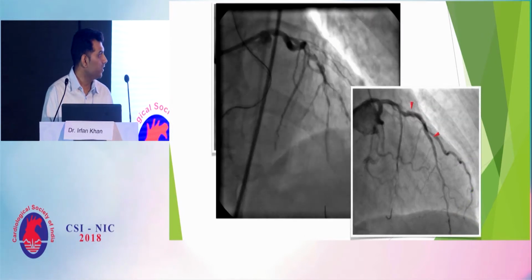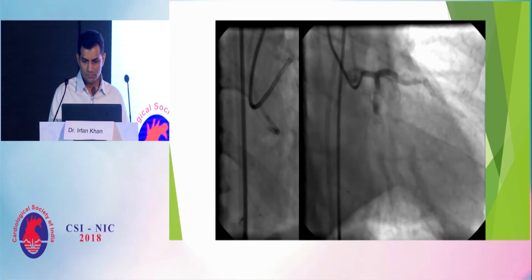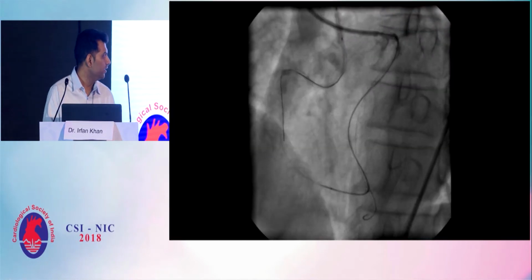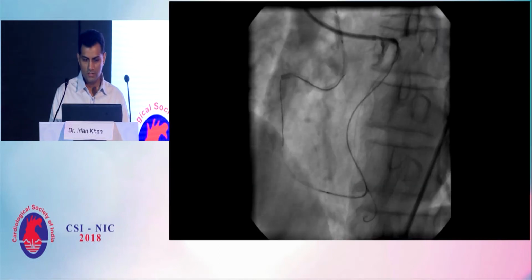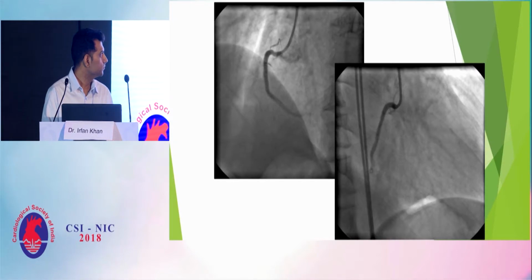So at that point of time, the mid LAD and the proximal LAD stenting was done. After securing the mid LAD and the proximal LAD, the RCA CTO was recanalized using a reverse CART technique. This is the final picture.